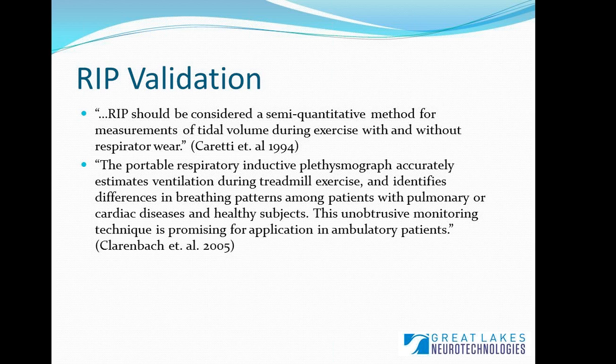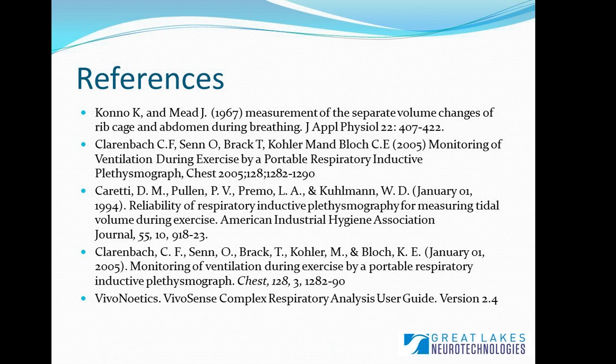So here's some references from my talk, and just to kind of bring everything back together, respiratory inductance plethysmography is a great method to measure respiration and derive several respiratory parameters like volume, flow, and respiratory rate in an unobtrusive and easy to use way instead of using that pneumotachograph, which again may be perfect for certain applications, but if you have somebody who needs to move around or needs to be in a more natural environment, RIP belts are a really nice solution for that.